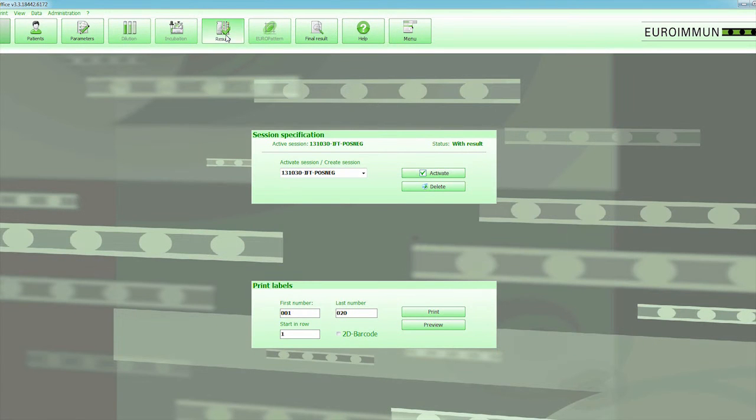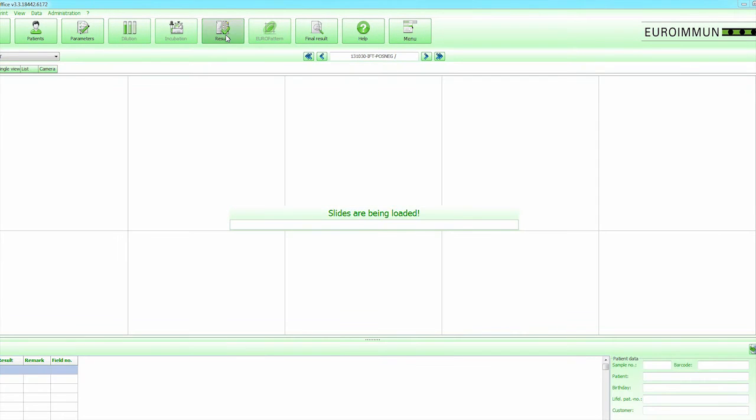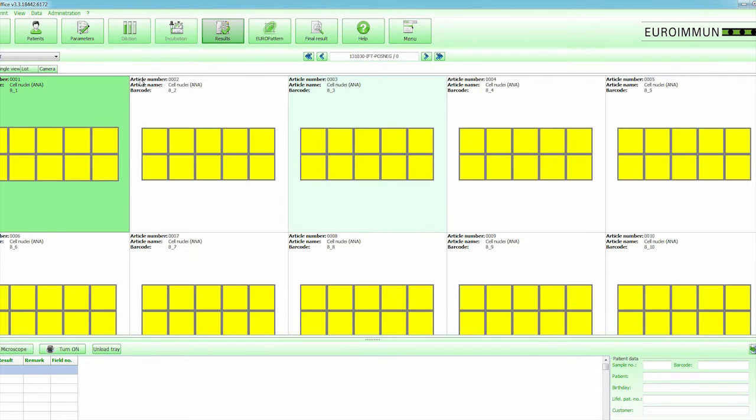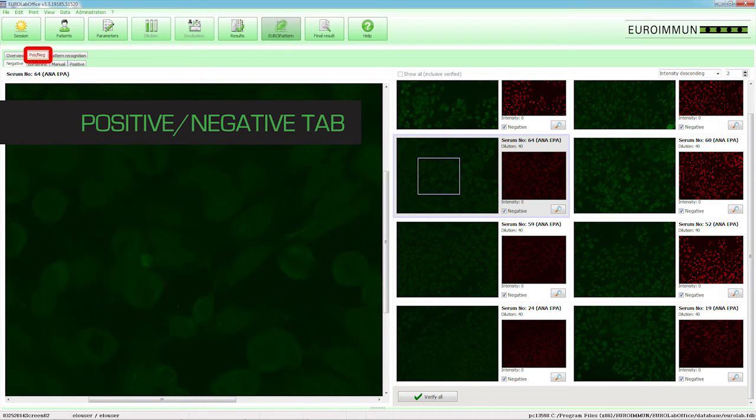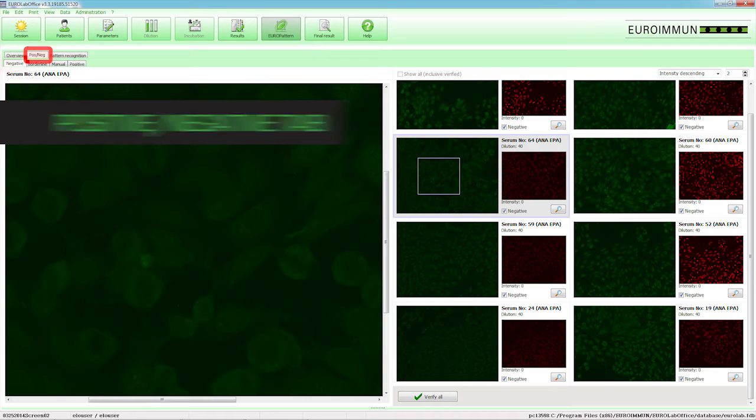Click on the Results button in the toolbar to display the overall view of results. In the Positive-Negative tab, all results are batched according to their qualitative results.